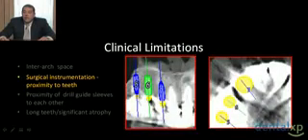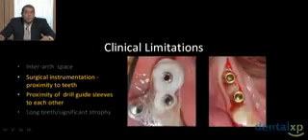So the way that I'll do this is not just plan and position my implants, but then I'll place an abutment system on top of the implant that will mimic not the dimensions of the abutment, but the dimensions of the surgical component that will be within the surgical guide, and see if that imposes on adjacent teeth or on the implant-to-implant relationships. Because it may also dictate, relative to the aesthetic positioning and sizing of the teeth, that we use a surgical guidance system that allows for the appropriate sizing and dimension, due to the surgical limitations of that particular case.